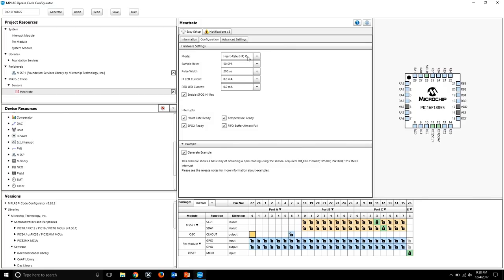So from there, I have the mode set to heart rate only, which is already selected. Now the sample rate I have to select is 100 samples per second. So I'm just going to select 100 samples per second. And the next thing is pulse width of 1600 microseconds. So I'm just going to set the pulse width to 1600 microseconds. And these numbers actually represent something. If you look at the data sheet, which we looked at on the click board, this is the best resolution you can get with these possible numbers.